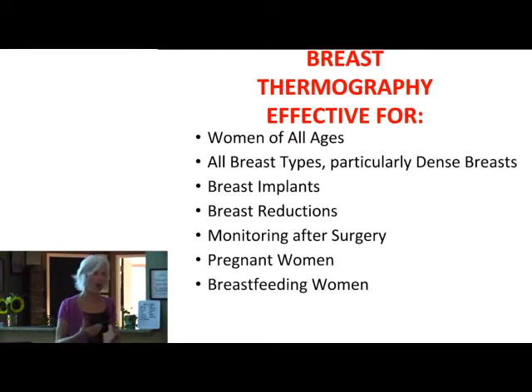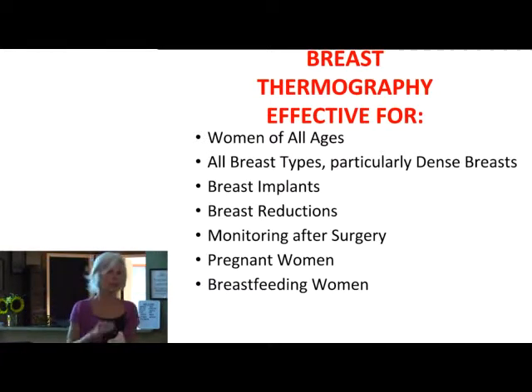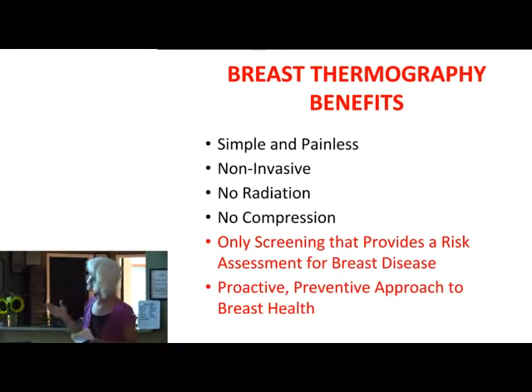I don't require that you come day 6 through 10 of your period, but what I do like is to re-image people during the same time of their cycle, because then we can compare apples to apples. But actually, Dr. Wren says day 6 through 10 of your cycle is ideal to do a thermogram. So I always get the day 1 of your period indicated. Simple and painless, you can see how simple it is. And as I mentioned, it's attractive to a lot of women because it isn't invasive, there is no radiation, and it doesn't hurt.